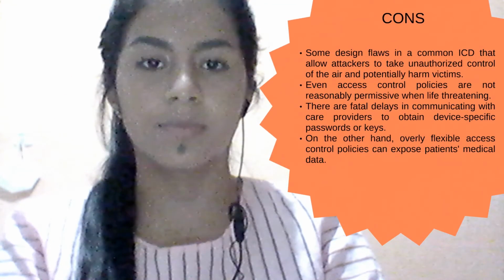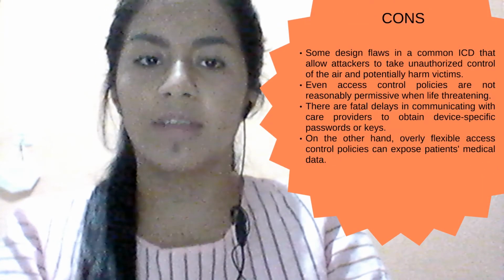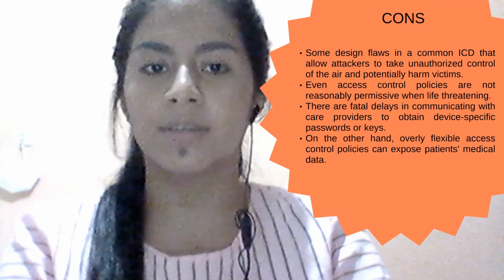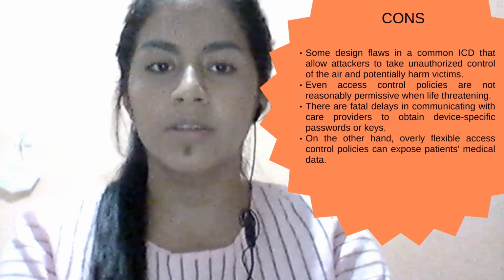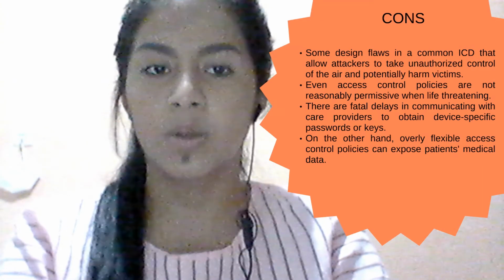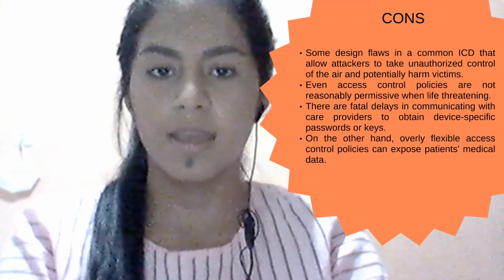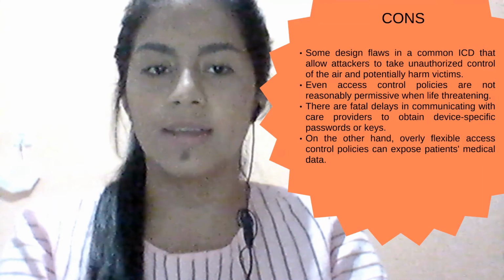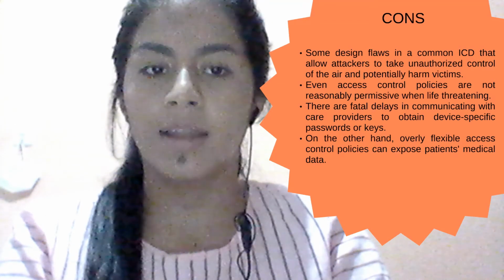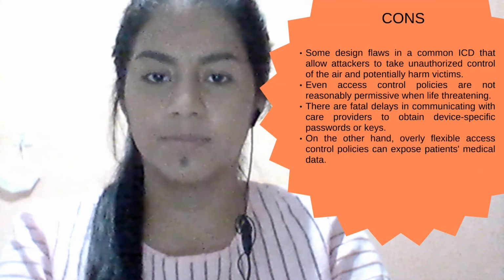Cons. There are some design flaws in a common ICD that allow attackers to take unauthorized control of the device and potentially harm victims. Even access control policies are not reasonably permissive when life is threatened.